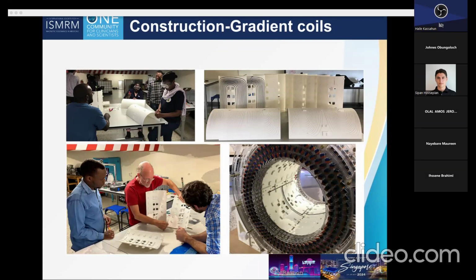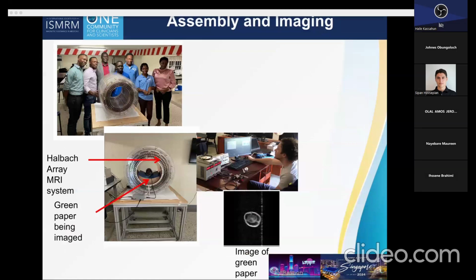I suppose that many of you will be constructing this in the summer to see how easy or how difficult it is to assemble a system like that. These are relatively portable systems that you can put at the side of the bed. You can image small samples, but even the head of a human being should be able to fit in.